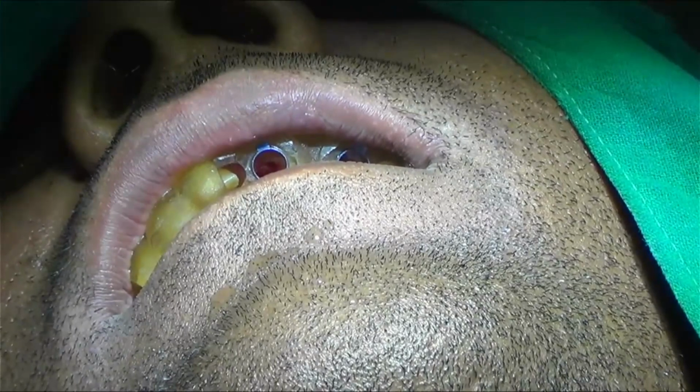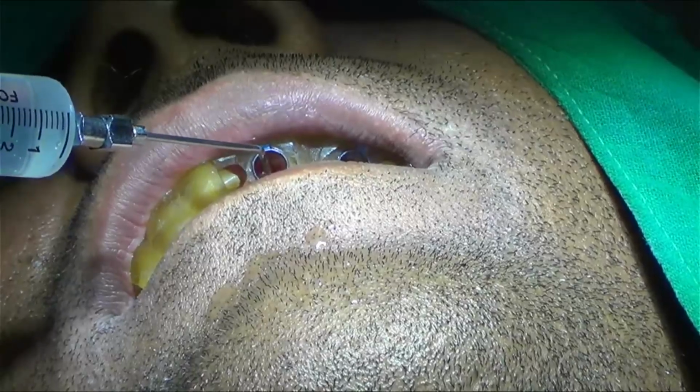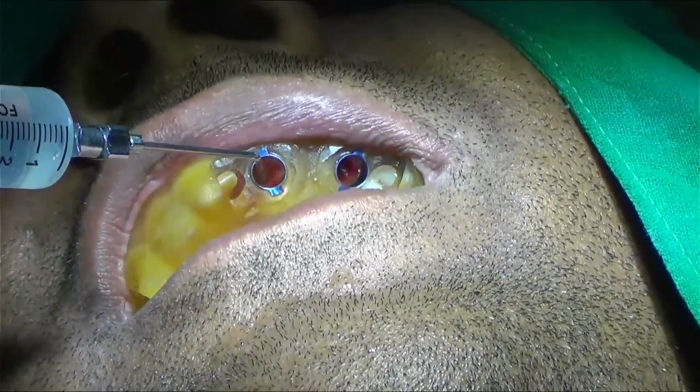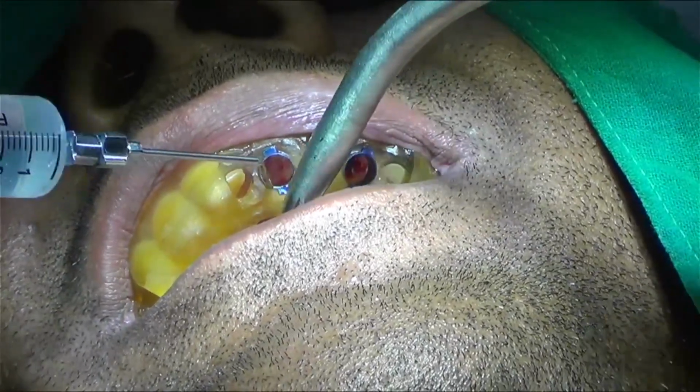Now, once I have touched the bone, I am always going to use the saline.